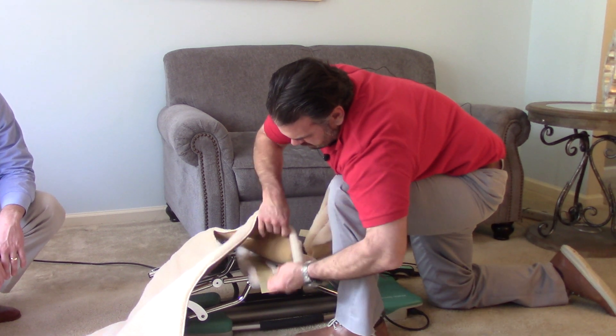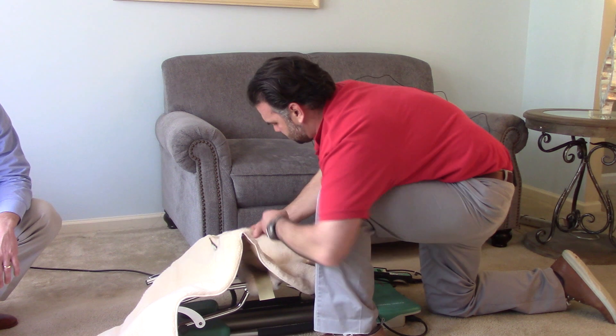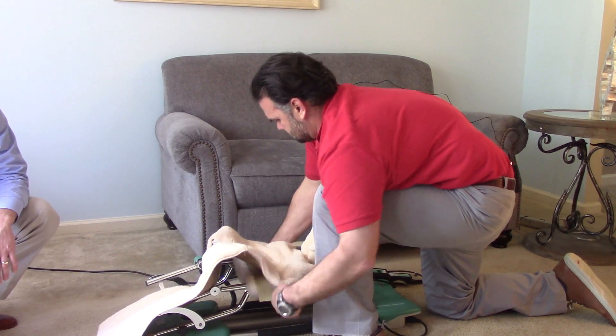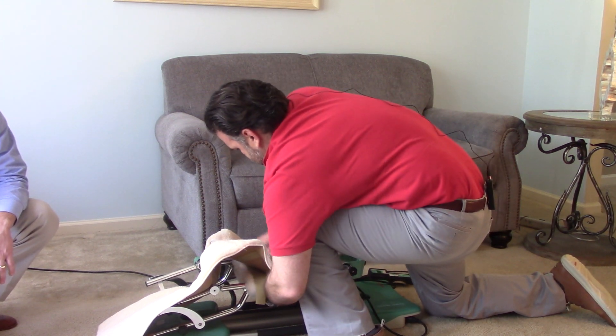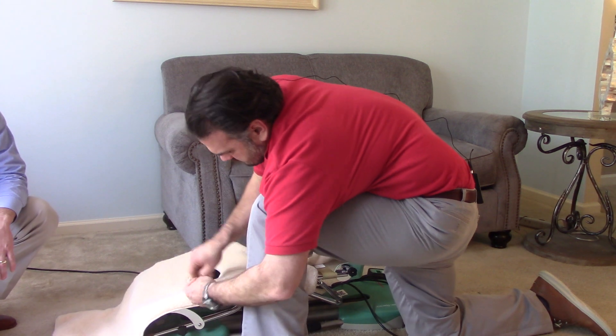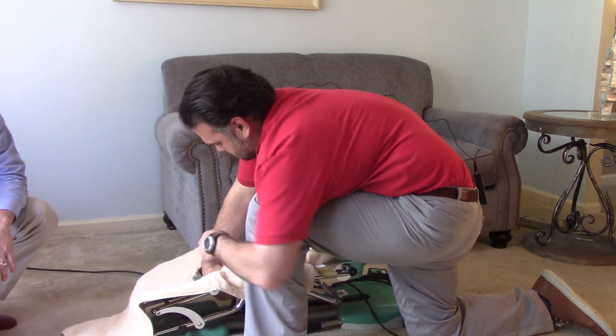We'll just go around the frame, come down here, and the same thing here.